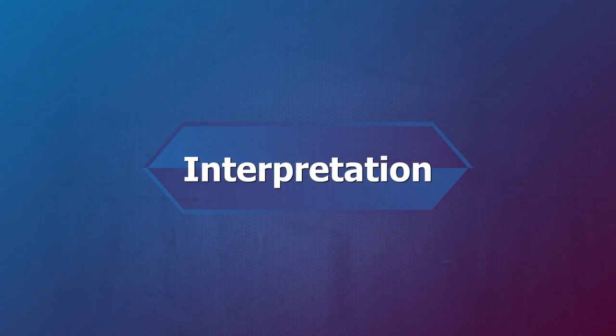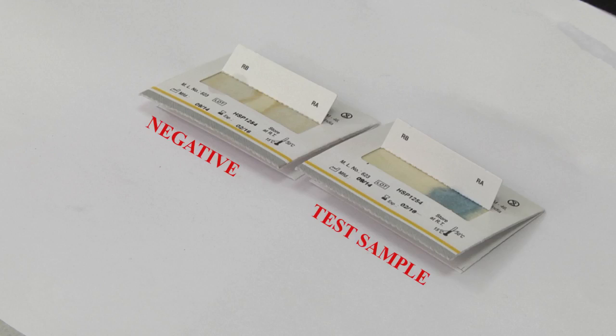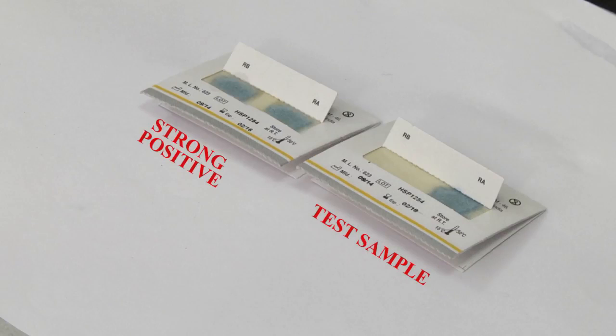Interpretation of results. No blue color indicates absence of occult blood in the stool. Trace blue coloration indicates presence of approximately 5 milligrams per deciliter of occult blood in the stool. Strong blue coloration indicates significantly more than 5 milligrams per deciliter of occult blood in the stool.